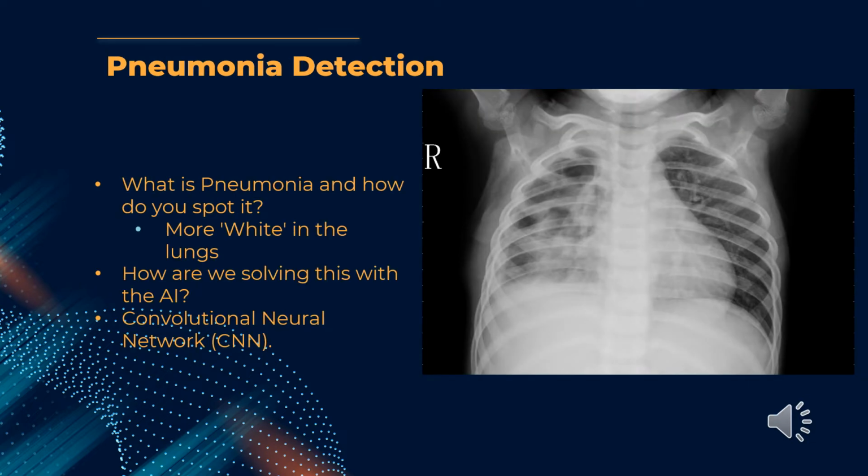The diagnosis involves inspecting the lungs in the X-ray to find spots with more white in them. This is due to the reflection from the fluid that collects within the lungs.